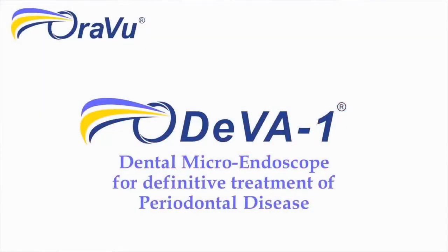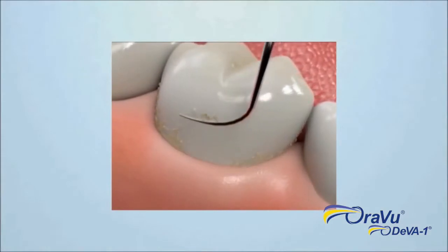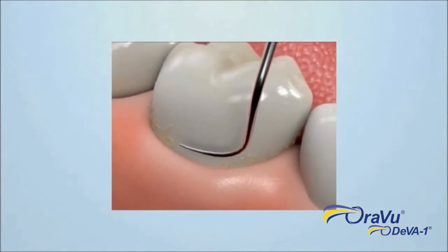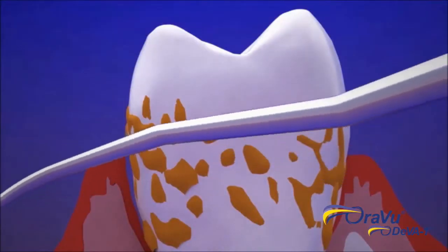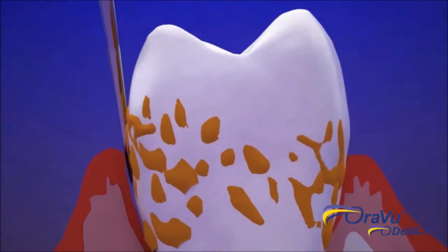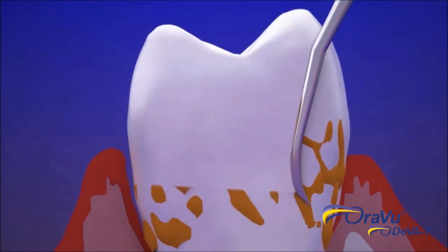OraVu presents the DeVA-1. Blind scaling and root planing is the first step to removing plaque and calculus below the gum line. Research proves SRP is not effective below 5 millimeters because it is a blind procedure, and even the best clinician cannot see everything.